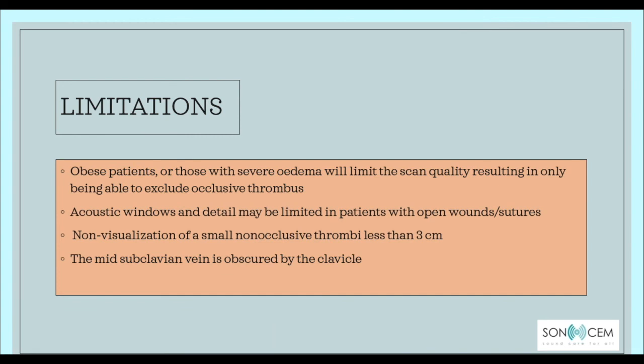And we have to bear in mind there can be non-visualization of a small non-occlusive thrombus if it is less than 3 centimeters. And specifically at the mid-subclavian vein, we can miss a thrombosis as it can be obscured by the clavicle.